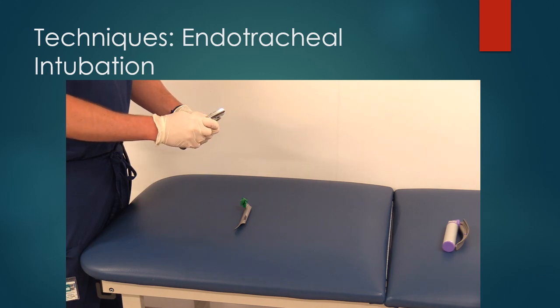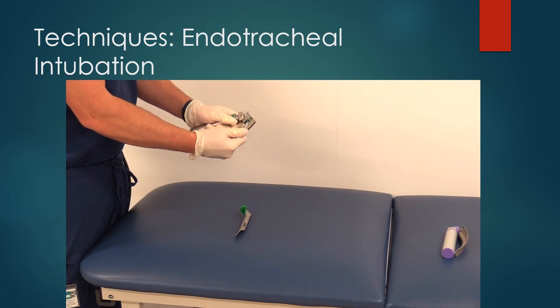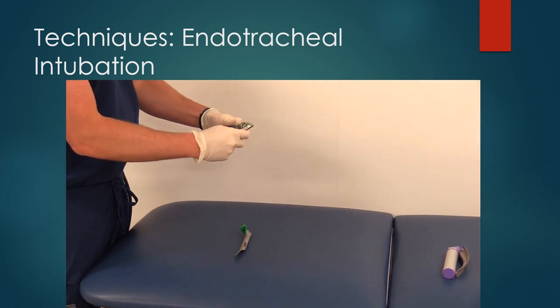To check it, gently attach the blade as shown.